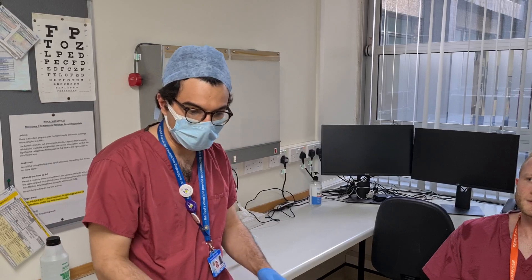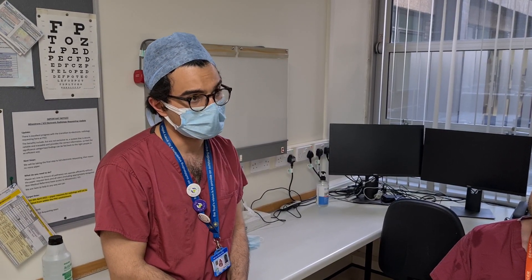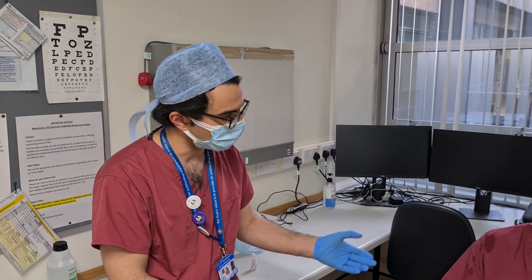This is a procedure used as an extension of your examination when you're assessing someone in an ENT clinic or an acute setting, to see how their larynx looks, and hopefully we can teach you to make it a little bit easier for yourself and for the patients with a few tips. We've got a stack here which, as we do the procedure on Dr. Ringrose, we can look at the different structures and what we look out for.